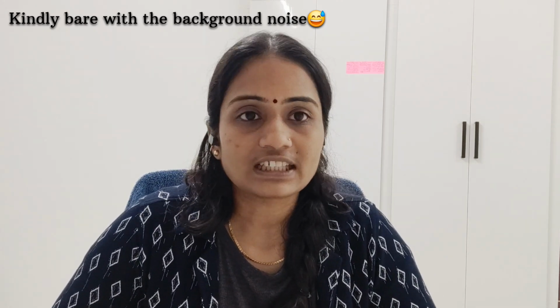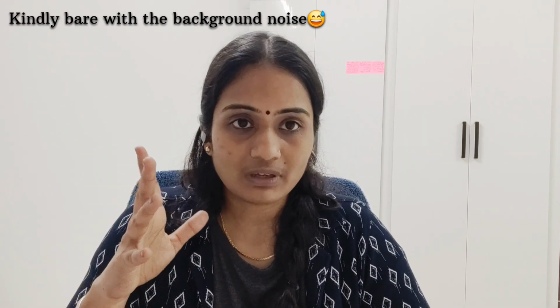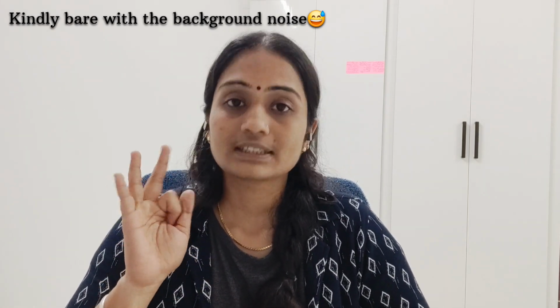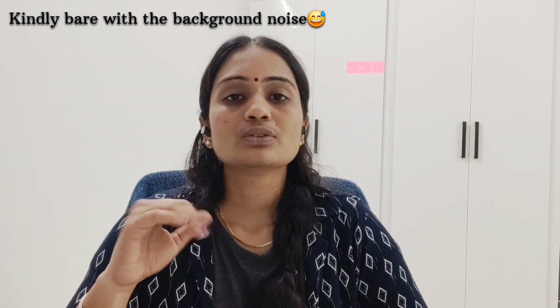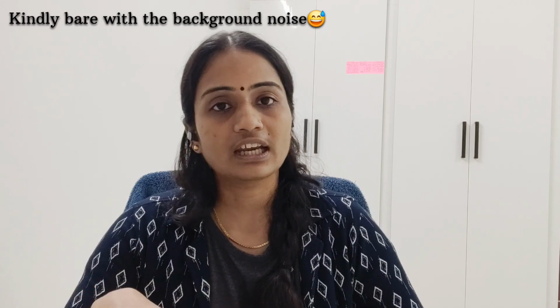So let's get started. There are totally 5 types of primary impression techniques in complete denture, namely mucostatic, mucocompressive, selective pressure, myostatic and dynamic impression making technique. First of all, mucostatic. Mucostatic was given by Richardson and Henry Page.